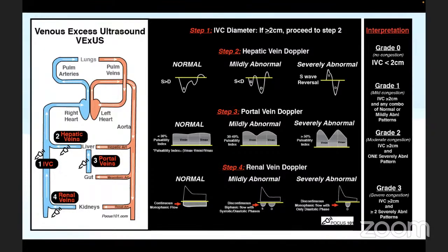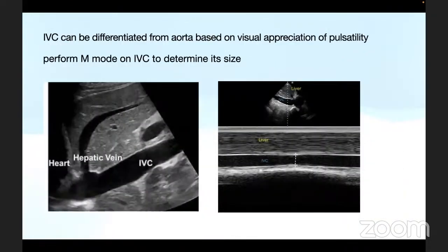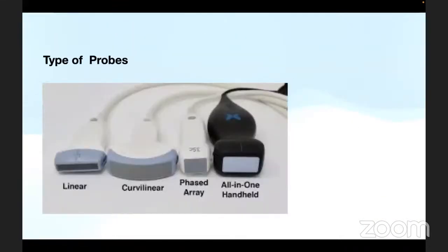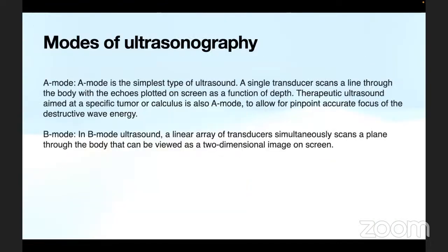You showed one probe now, an all-in-one probe. Yes, sir. Is it available? I don't know, sir. Maybe it is available with some new ultrasound machines, sir, but it is not very effective. Okay. And the picture is showing the Butterfly one, it is very costly. Which is the butterfly one? I'll show one, Butterfly and company, sir.